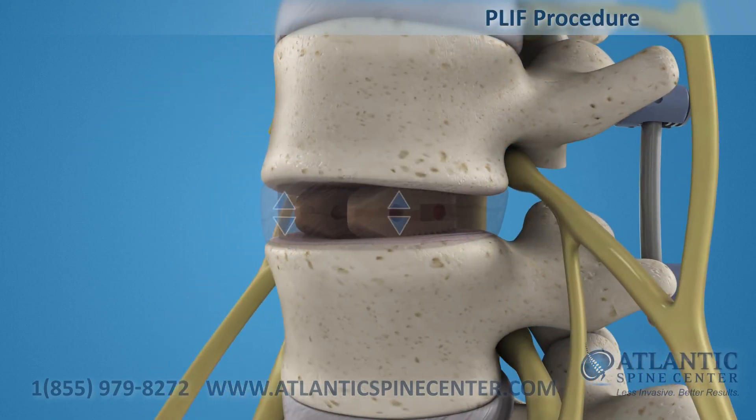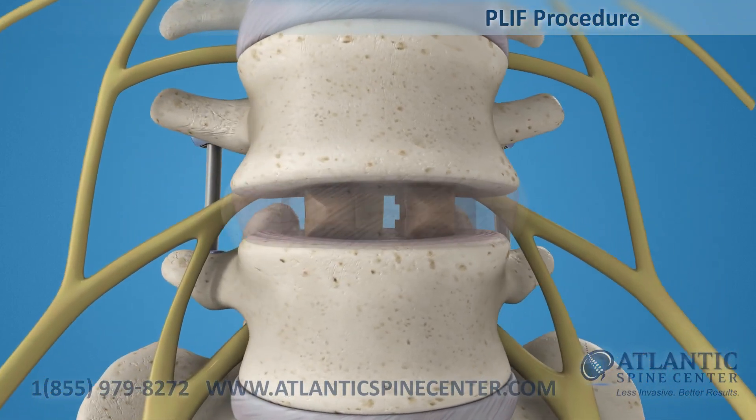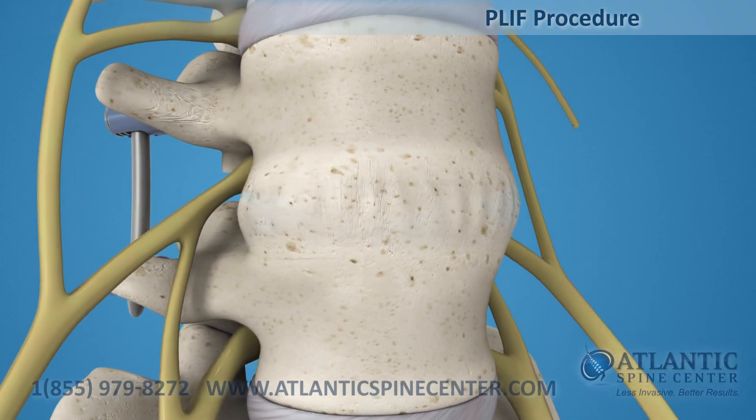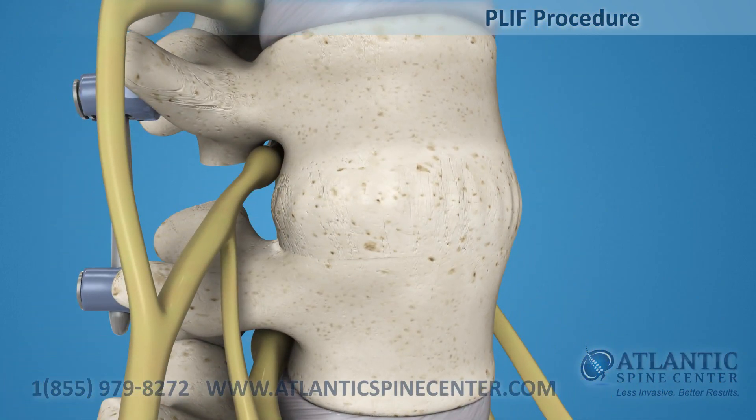The implant maintains the spacing of the vertebrae while the fusion takes place. After the fusion is completed and a solid bone mass forms, the two vertebrae are joined together.